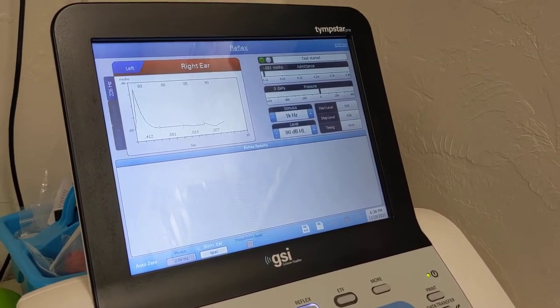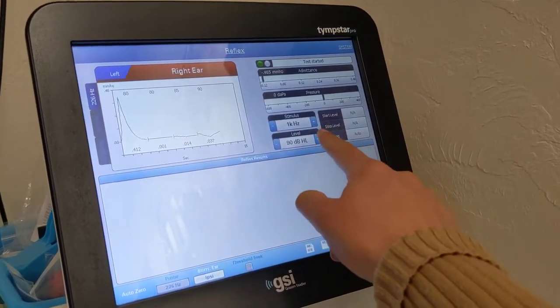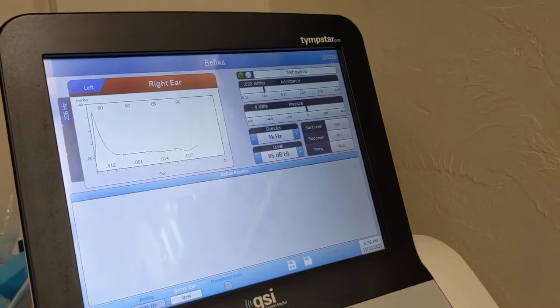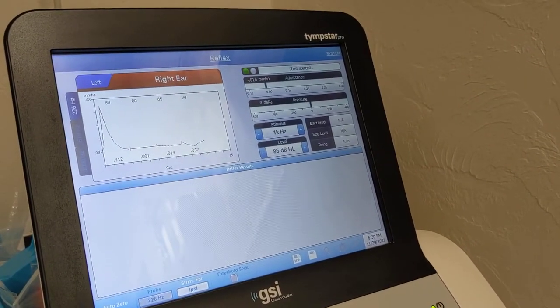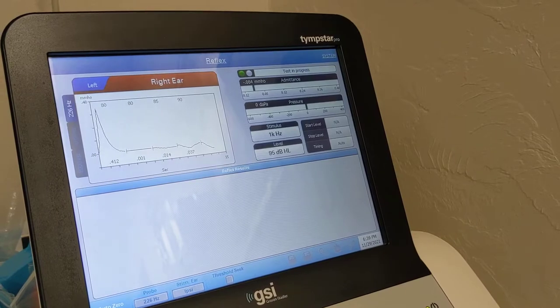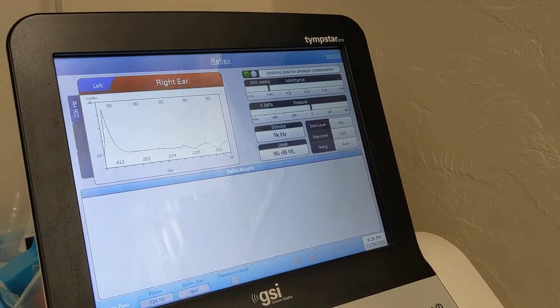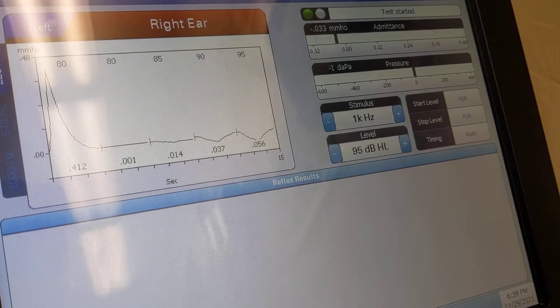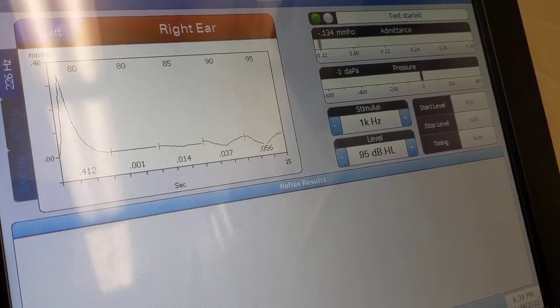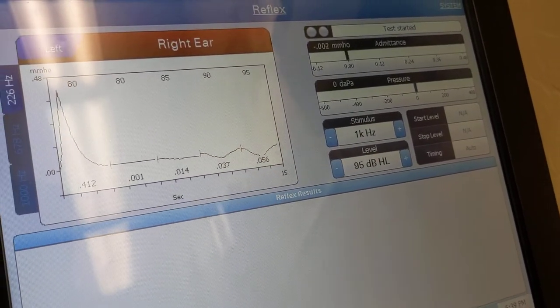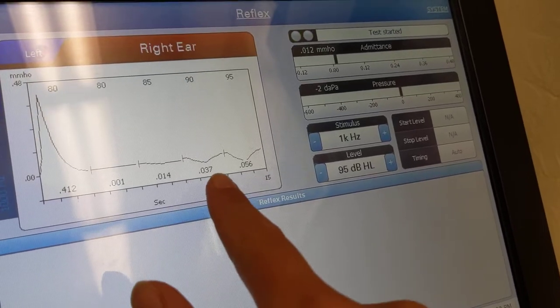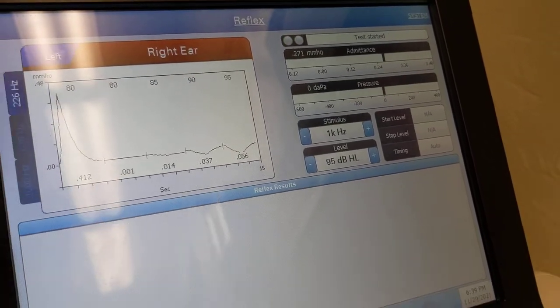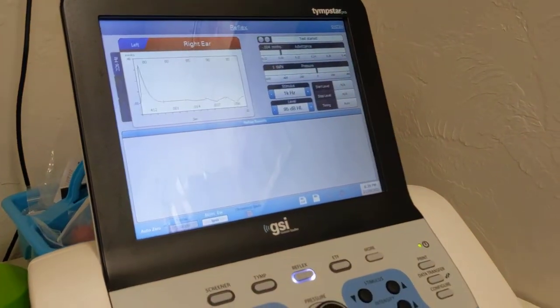So let's see if we can get some growth. So I'm gonna increase it to 95 and present. Okay, great. And we did get some growth at 95 dB. You can see 0.05, increase by about 0.02.